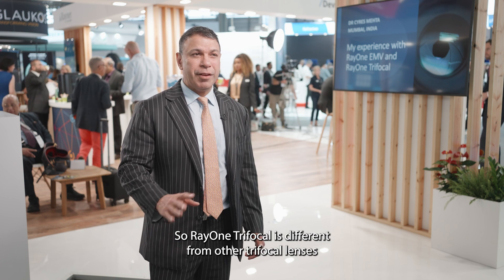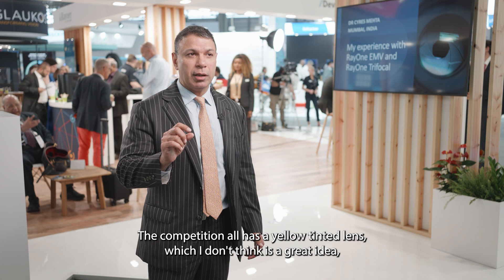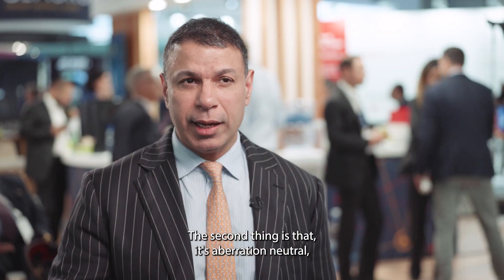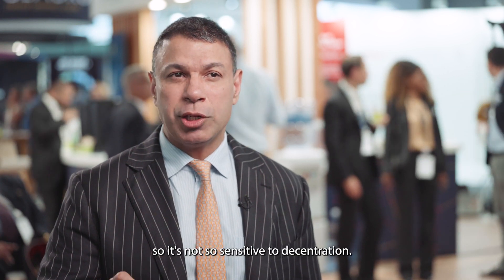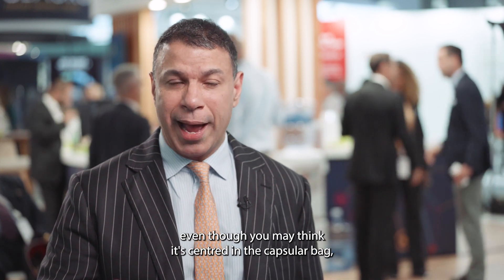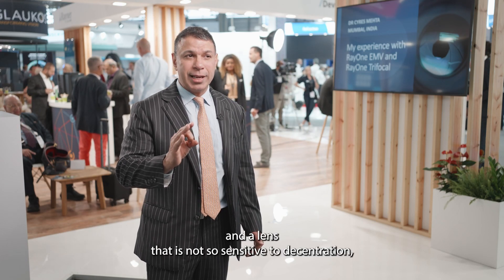The Ray 1 Trifocal differs from other trifocals: first, it's clear — the competition all has a yellow tinted lens. Second, it's aberration neutral, so it's not sensitive to decentration. Whenever you implant a lens, even if it appears centered in the capsular bag, the pupil is probably not at the exact same center — so there's some decentration in every patient. A lens less sensitive to decentration, like the Rayner Trifocal, will outperform the competition.